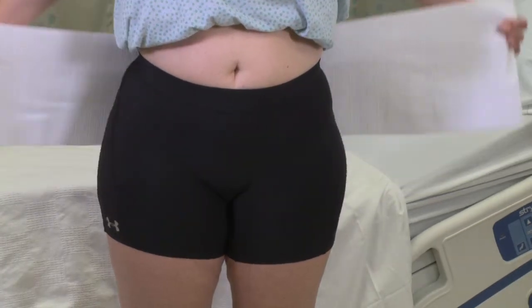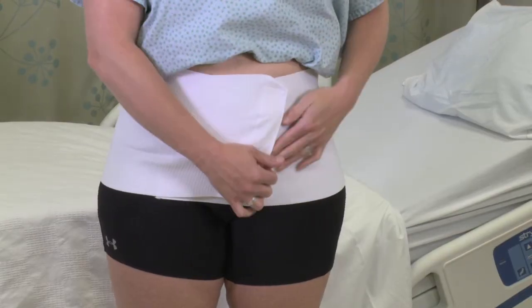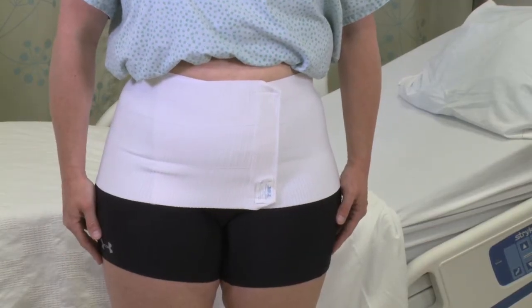Then stretch both ends out sideways. Wrap one end around and then the other. Finally, press fasten the continuous hook closure and position the binder for an ideal fit.